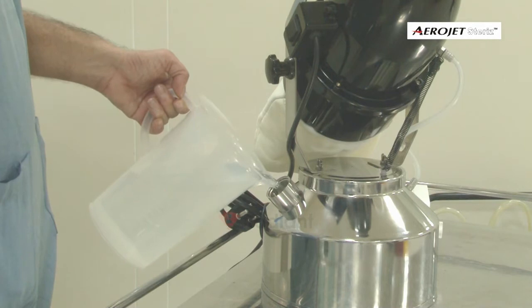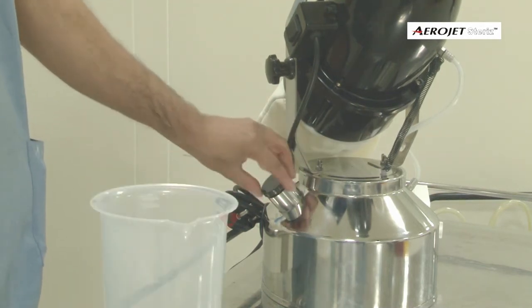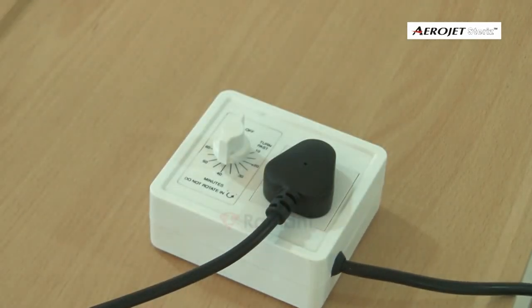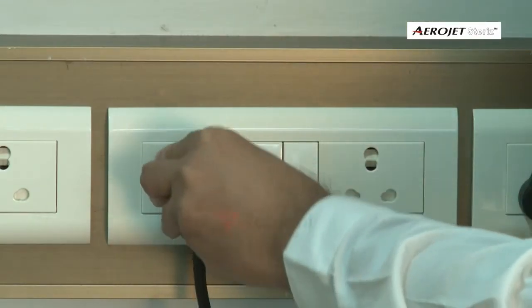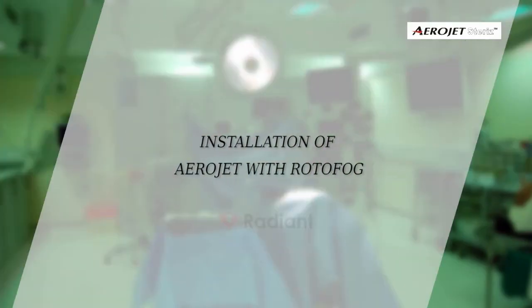Fill the measured disinfectant solution into the tank and close the tank lid. Connect the power cable of the machine into the timer socket and the timer cable into the power mains.